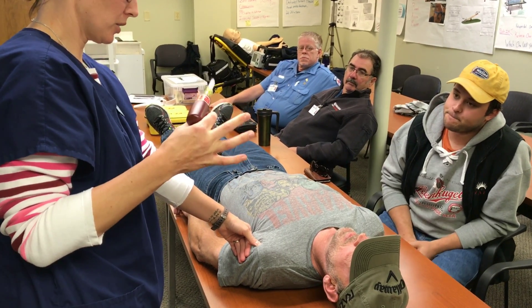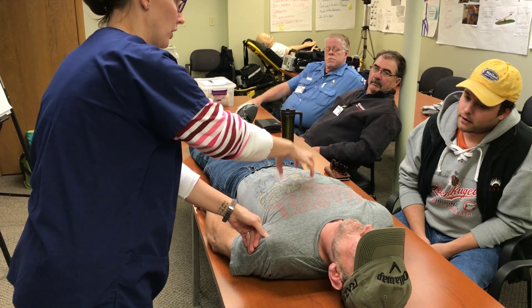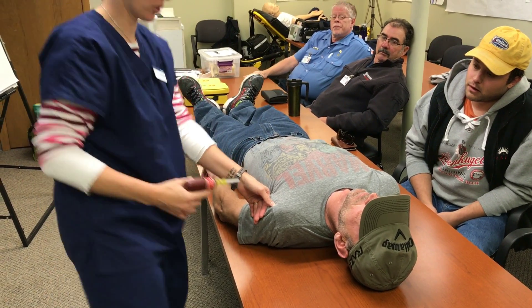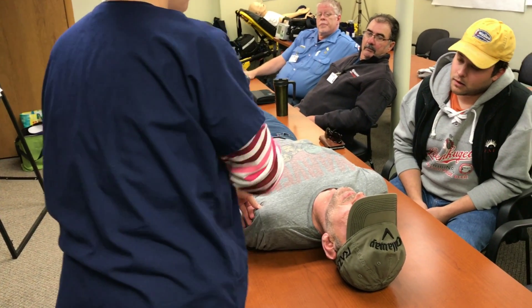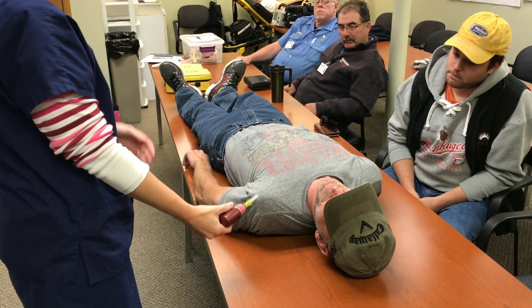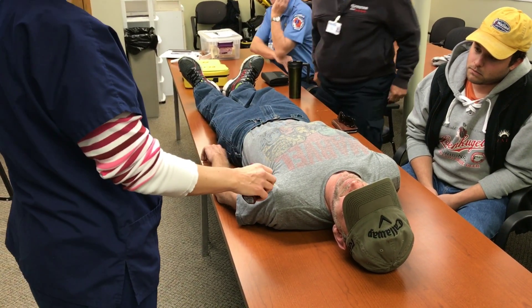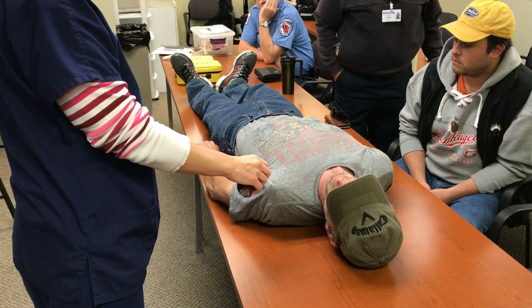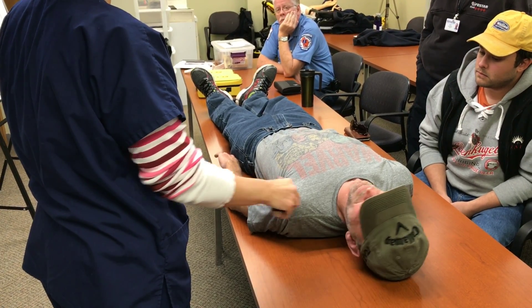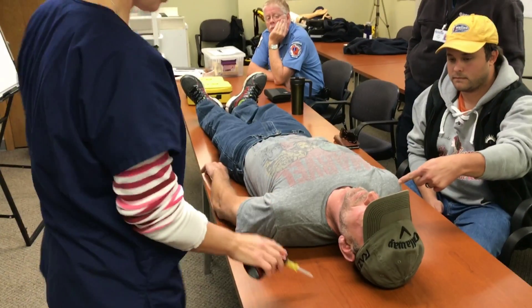Now the 45-degree angles. You want everything to go toward the core. Going straight across heads to the other shoulder — not good. Going straight down the arm — not good. You want to angle toward the core, that's the first 45 degrees. The second 45 degrees is up off the table: don't go in flat and don't go down toward the back — go in toward the core. So: 45-millimeter needle at 45 degrees in both planes.